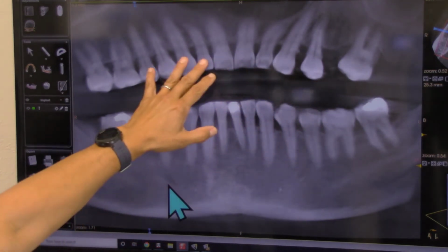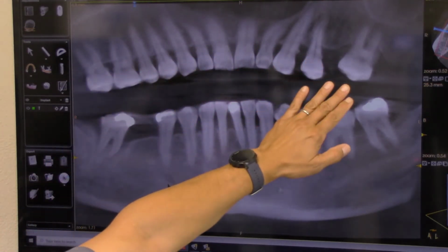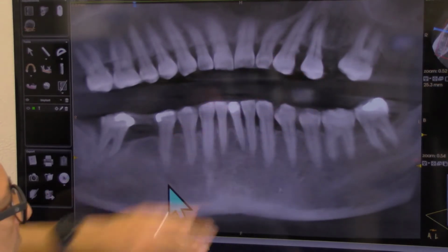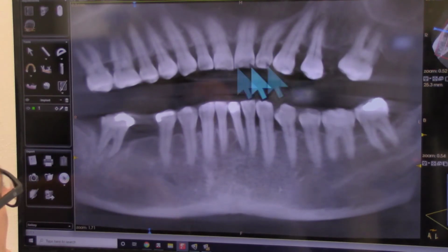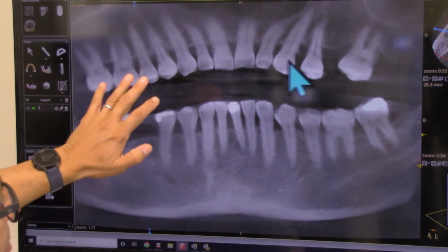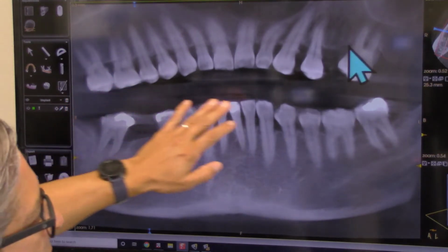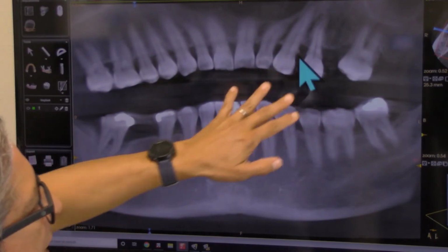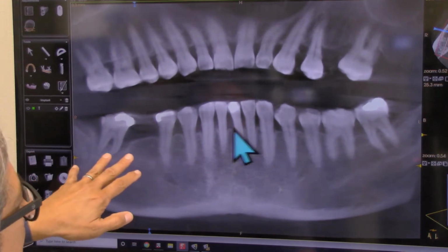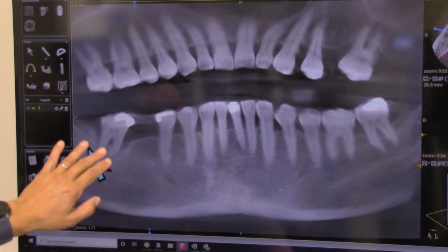But here is the periodontal problem too. Not only is it negligent on replacing teeth, but because there's a periodontal problem, you can see the calculus showing up right here. A big chunk of calculus right there. There's chunks of calculus all through the teeth, all through here as well. So what happens is that this patient is getting a lot of vertical bone loss around the teeth that have the calculus. So she's starting to lose bone here. She's losing bone here. There's a horizontal bone loss, and then you get down to a molar area here, and you see a lot of vertical isolated bone loss here.